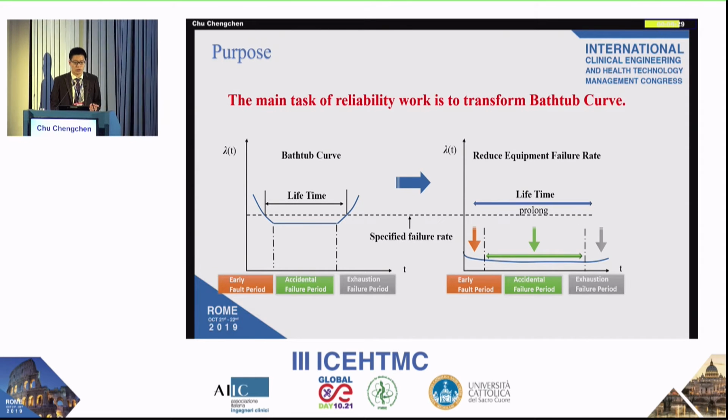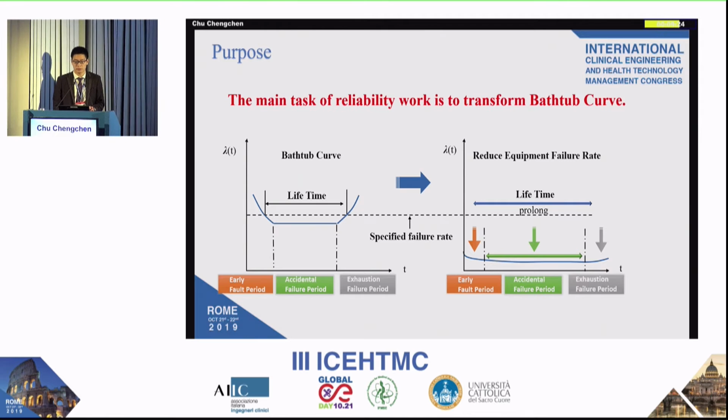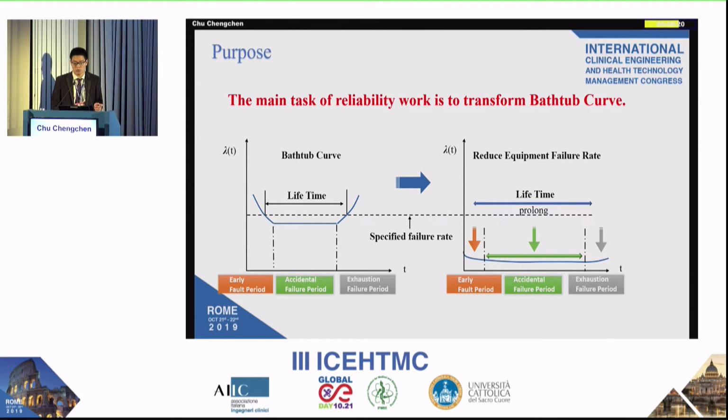So our research work is to transform the bathtub curve. We want, through preventive maintenance, to reduce the equipment failure rates and prolong the lifetime of the medical device.